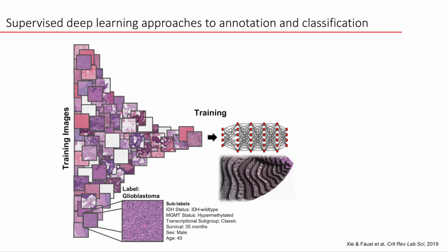What the neural network does during this process is it takes each image and looks for the lines and edges to break the image down into digital data, and as it passes that information through the neural network, it will start making more complex objects such as circles and ellipses, and it'll use that information to make more complex objects as it moves the image through these different layers of the neural network.